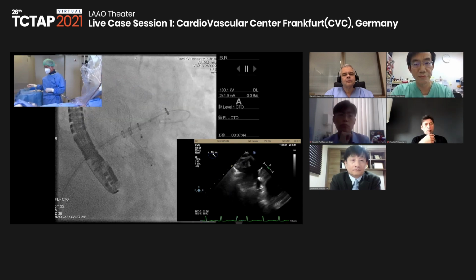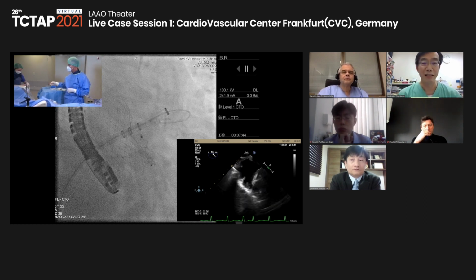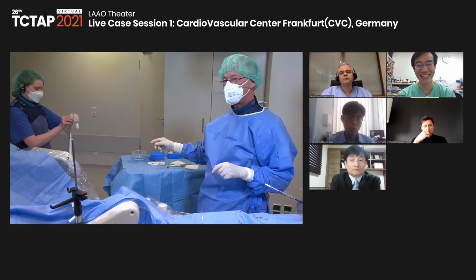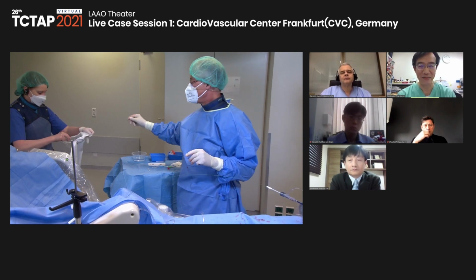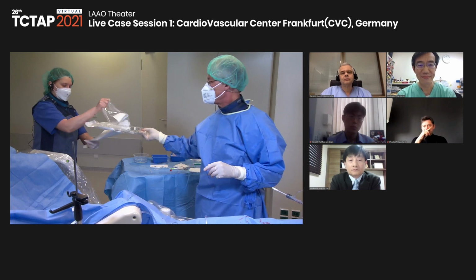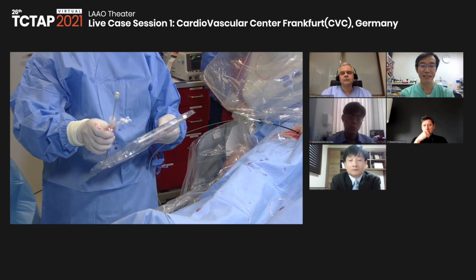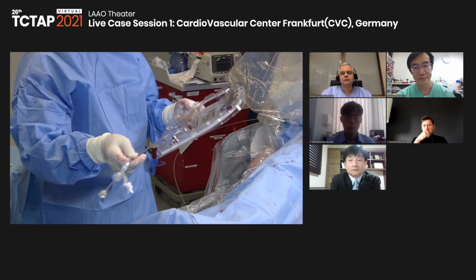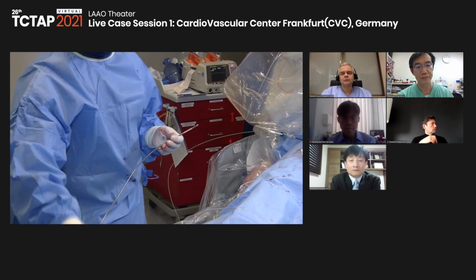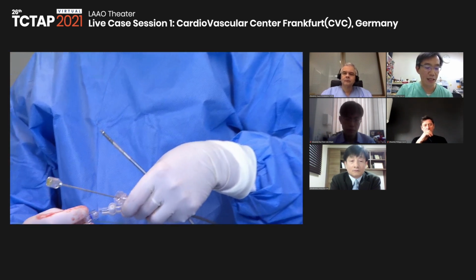Can I have the 35? You have only the super stiff guide wire in the appendage? No, it's extra stiff, not the super stiff. The super stiff is really too stiff. So it's important to use the Amplatz extra stiff with a 3 centimeter long tip. There's also another version, I think with a 9 or 10 centimeter long tip, and that is not good. So it's really only this particular wire, and it behaves like a pigtail. And that's why it's safe to do it this way.